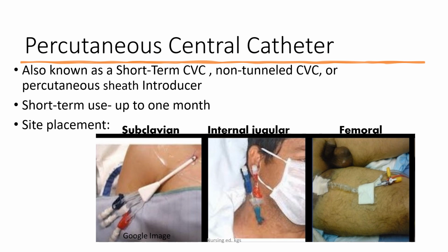If your patient will need a CVC for more than 2 weeks, then the medical team may need to consider referral for a more long-term CVC. Femoral CVCs that are inserted under emergency circumstances are normally changed or re-sited within 48 hours, and of course, follow your own hospital policies.